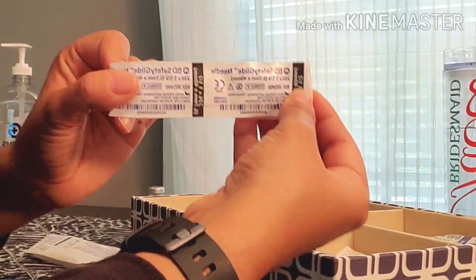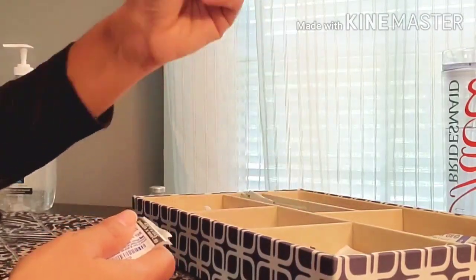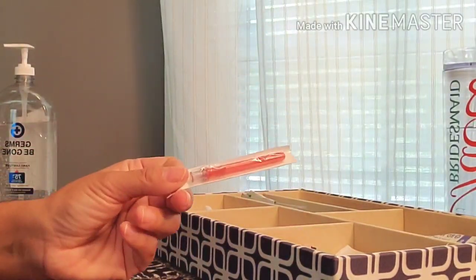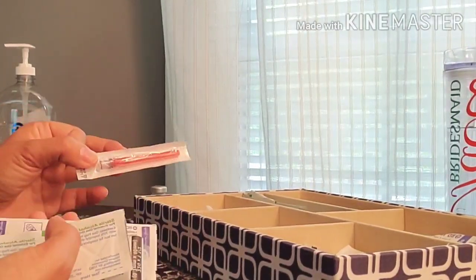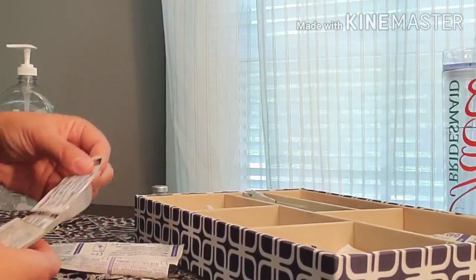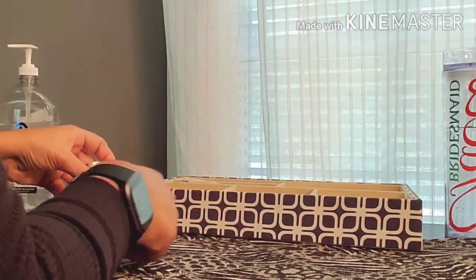I have my one milliliter syringe and my one and a half inch, 22-gauge needle — I chose 22 over 21 gauge. I also have alcohol, gauze, and because I need to withdraw this medication, I'll use a different needle for withdrawal than for administration. Many medications can be irritating to surrounding tissue, so it's best to use a blunt needle to withdraw the medicine. So I have my syringe, blunt needle for withdrawal, the actual IM needle, alcohol, and a gauze pad.